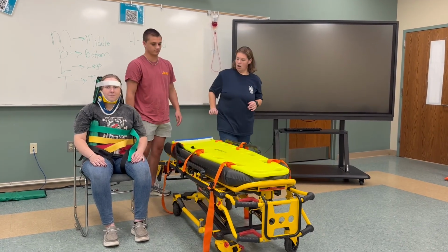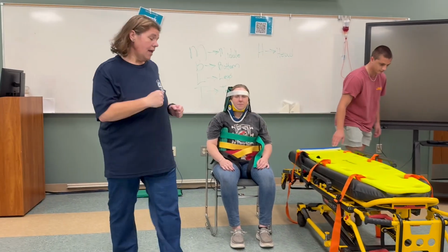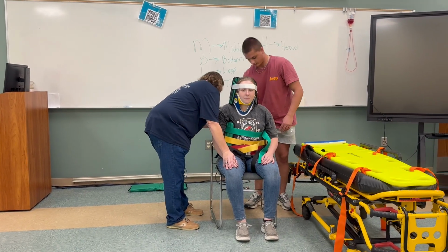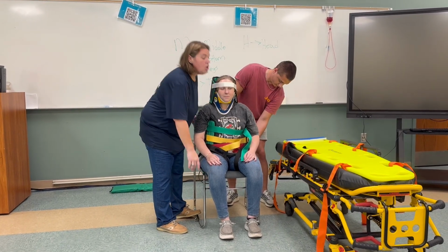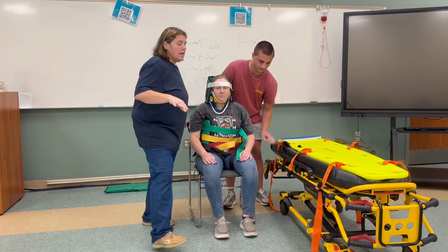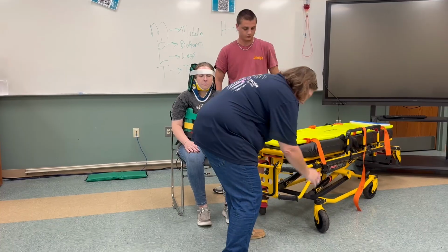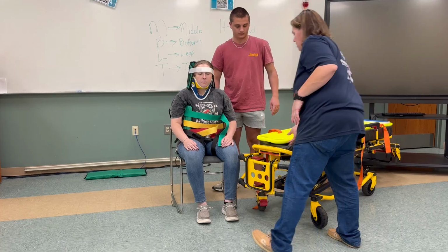That's my headlocks. All right. On a KED, there are 2 handles on the back of the patient. Right here and right there. And you will grab under the legs. So what me and my partner are going to do, or we're going to do it as you actually move a patient. So we're going to kind of spin our stretcher a little bit. And we're going to place this, I'm going to lock it underneath her body. Okay?